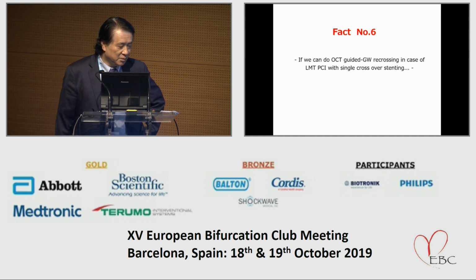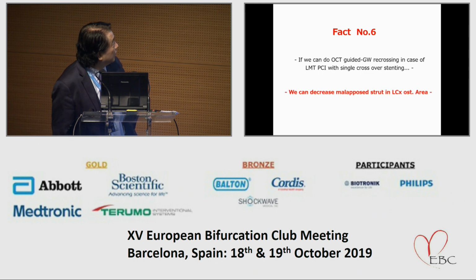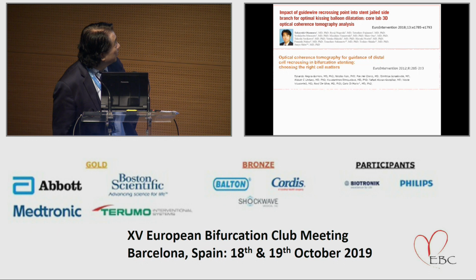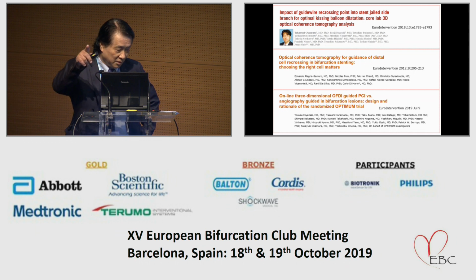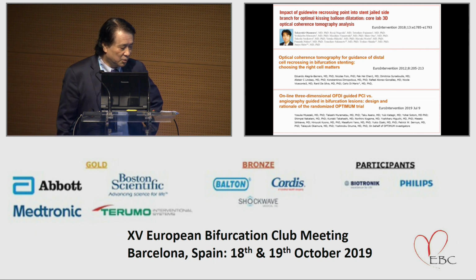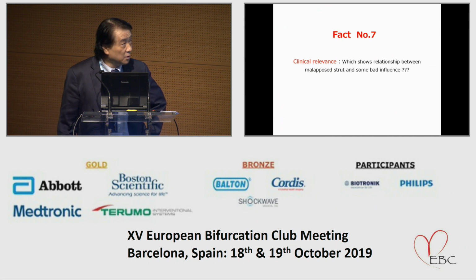Anyway, fact number 6 is we have a good method to recross at the good point. Actually, Dr. Okamura was here, and also Dr. Onova. We have 3 important papers. If you use OCT guidance, we can recross at the very good point, and we can do good kissing. They reported. Fact number 7, clinical relevance.